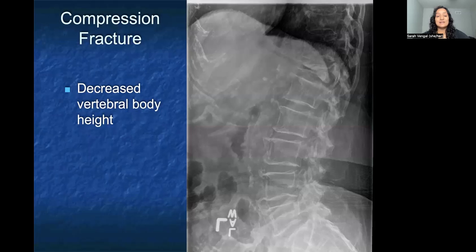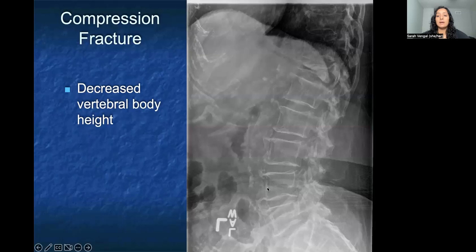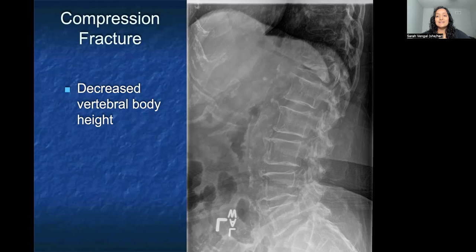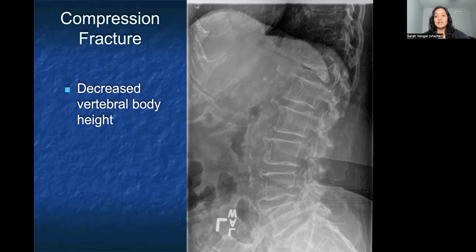The third most common thing I've seen in the thoracic spine is a compression fracture. On a lateral view, I'm looking at vertebral body heights working from top to bottom. They all look pretty uniform until one looks fairly squished — not rotated, because I'm not seeing different parts of the end plate, but actually squished together with a definite decrease in vertebral body height. This can happen for a variety of reasons; it's typical with osteopenia or osteoporosis, but I've also seen compression fractures from motor vehicle accidents or jumping on a trampoline. This is one of the main things to look for, especially when the patient has midline bony tenderness and is rigid or unwilling to rotate, flex, or extend.